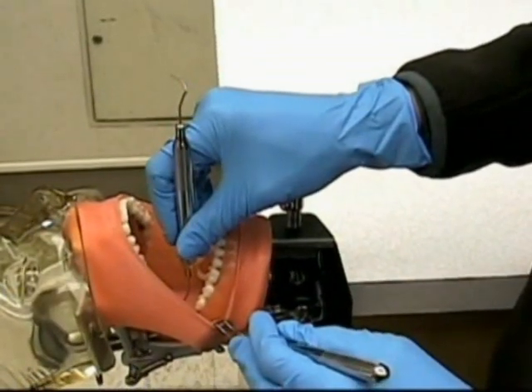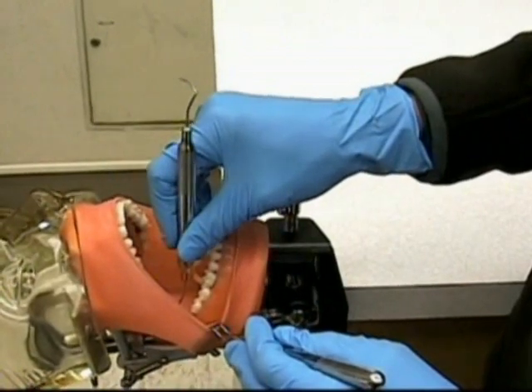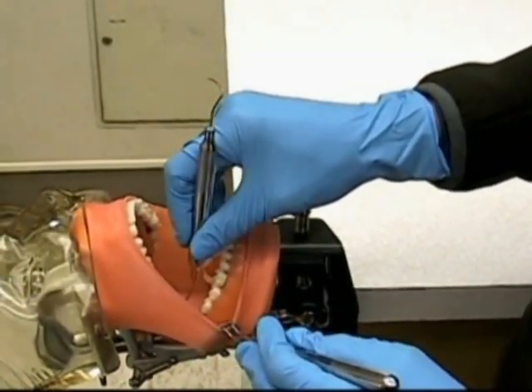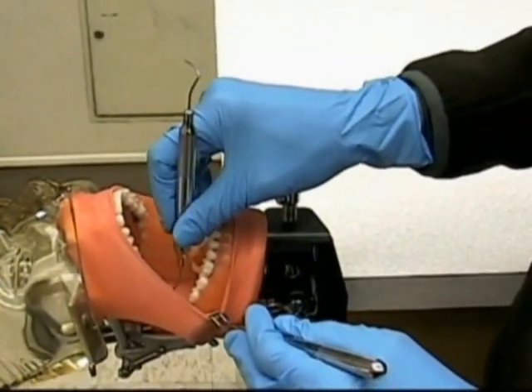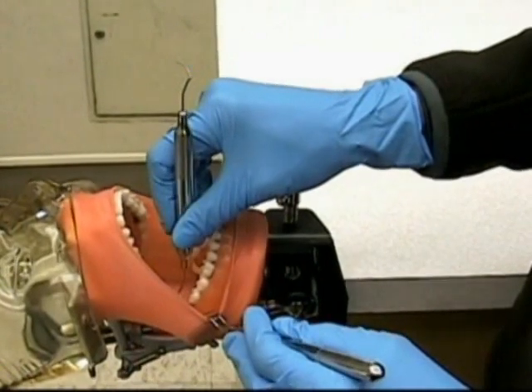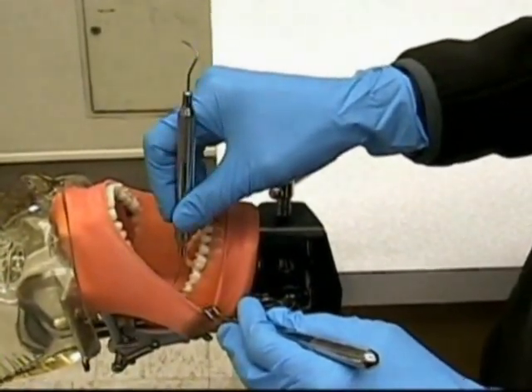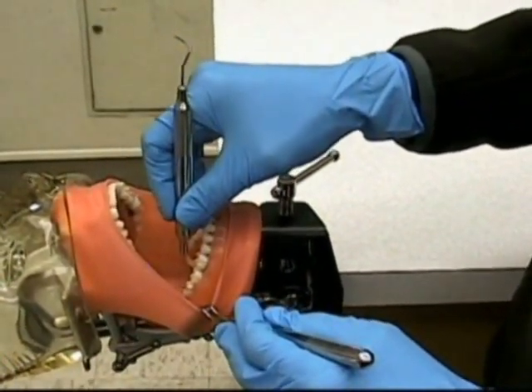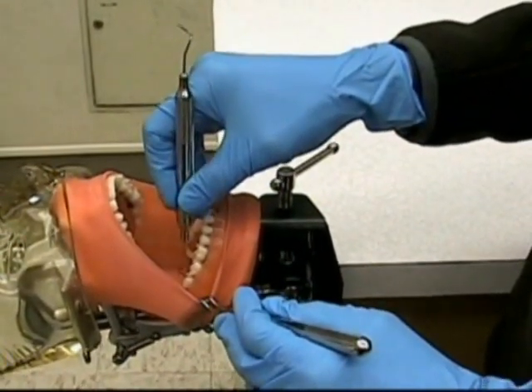Posterior teeth will begin at the distal line angle. On the leading edge, we will walk it back on the trailing edge to explore the distal. Walk it back. Turn it to the leading edge. When we get to the mesial line angle, roll it, pivot up on the fulcrum a little bit, and roll it interproximally.